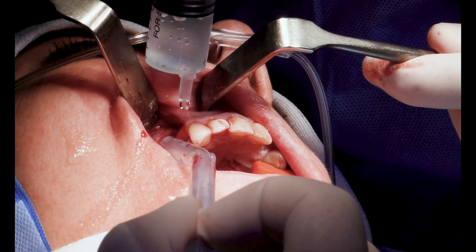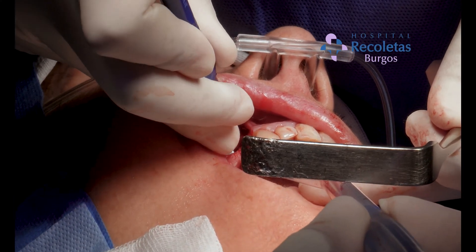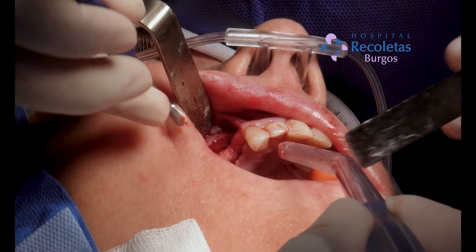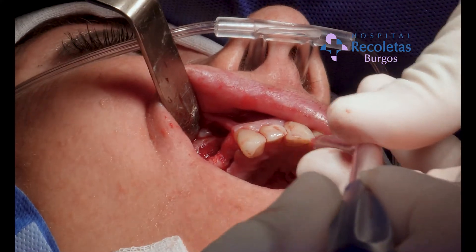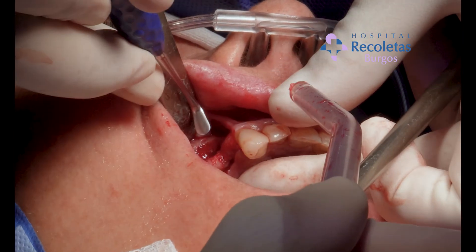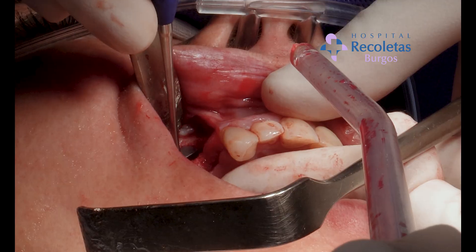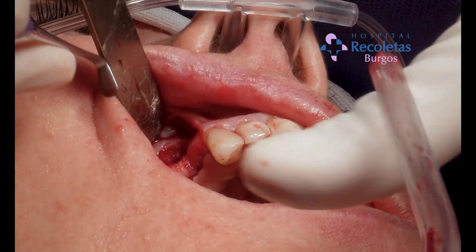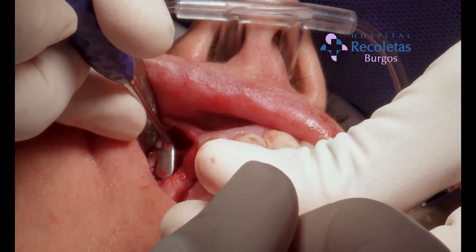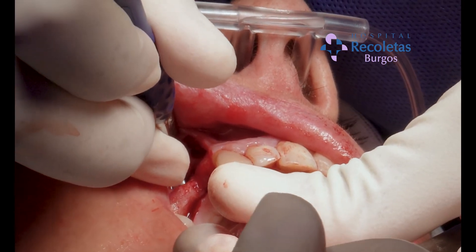We perform some irrigation to make sure that the membrane is intact, and then we make sure we have made the periosteal dissection enough so we can place the bone graft inside and there is no significant tension.